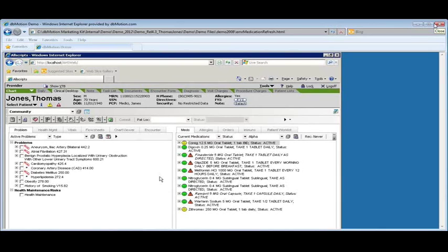I do have to point out that moving into the EMR piece, we're moving real rapidly on those workflows, and I'll talk more about those with Allscripts. We have the capability, because we do this standards-based with any EMR. Not all the EMRs are capable of taking a CCD and parsing it and saying, okay, I recognize that as a med, and it's got to go in this place on the med list or this place on the problem list.